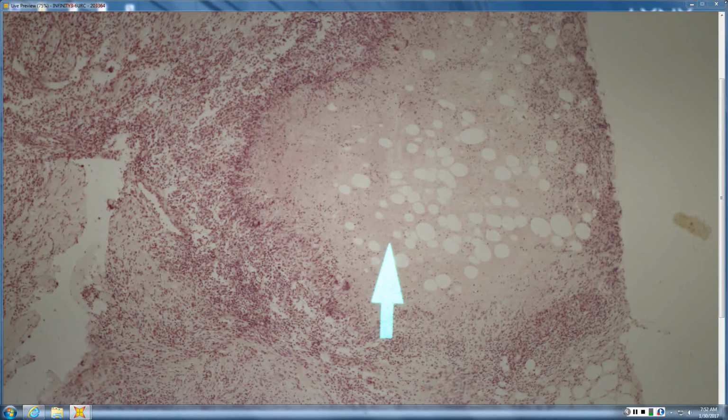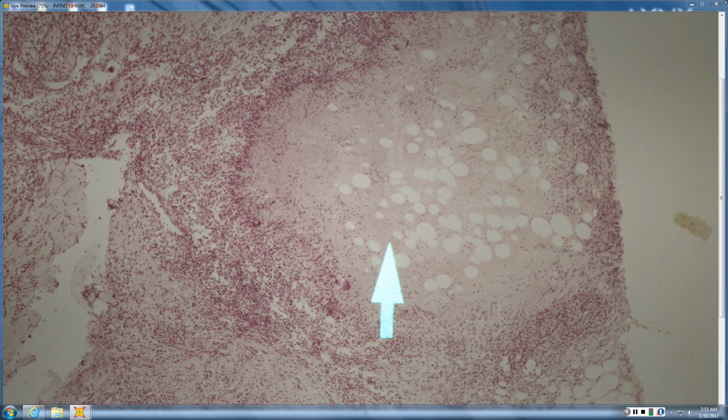If these things are about the size of a millet seed and were throughout your lung, what would you call it? Miliary tuberculosis. Yeah, like miliary tuberculosis, and this is just a miliary pattern in skin. And this was TB. What if you had all over your face little miliary caseating granulomas like that? Certainly disseminated miliary TB of the face could do that, right?